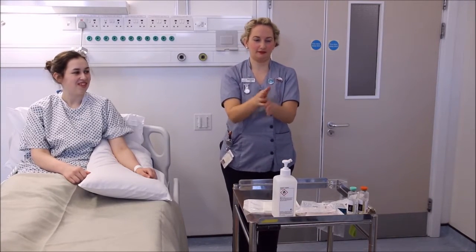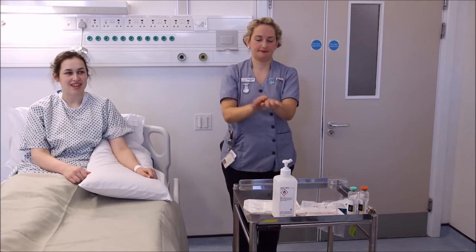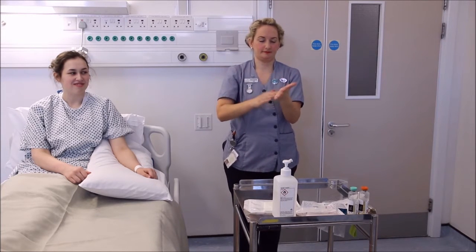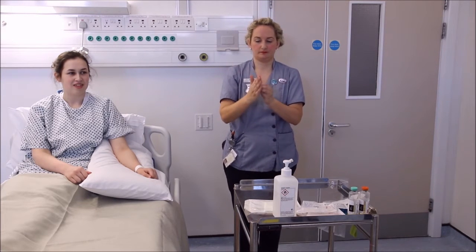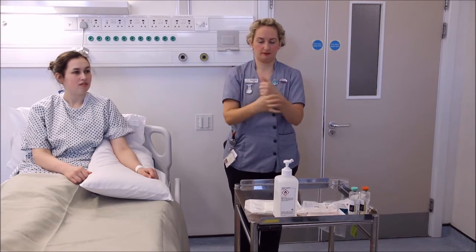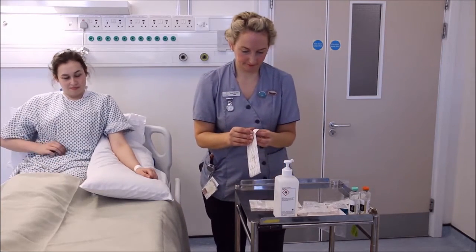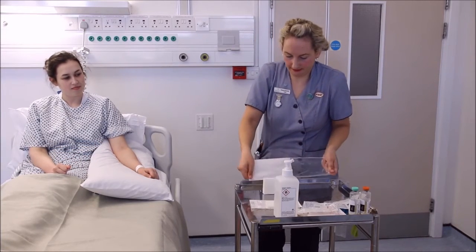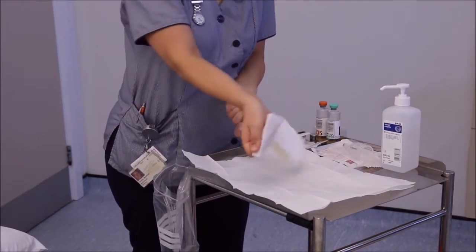Decontaminate hands. Open sterile drape. Decant equipment onto sterile field.